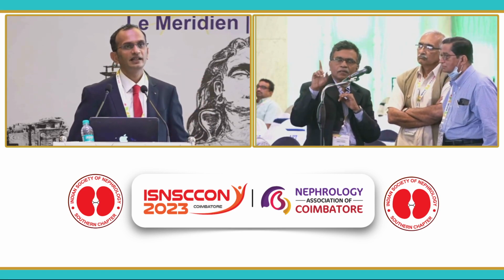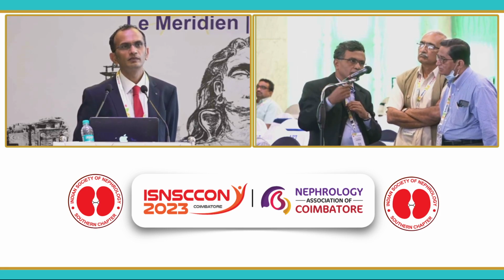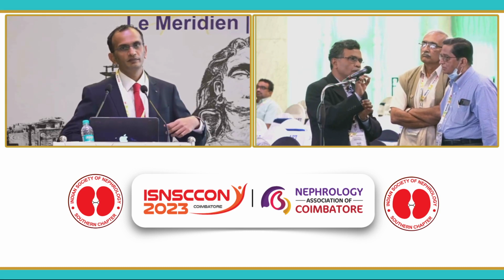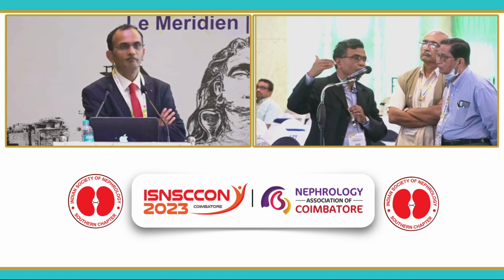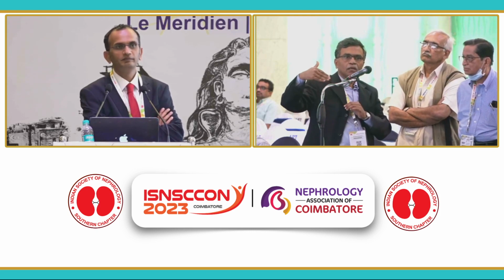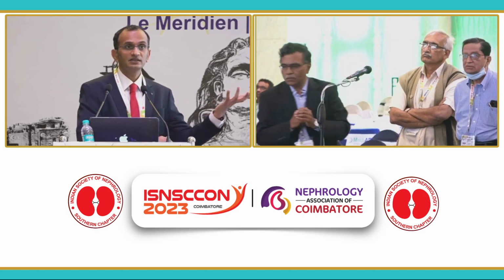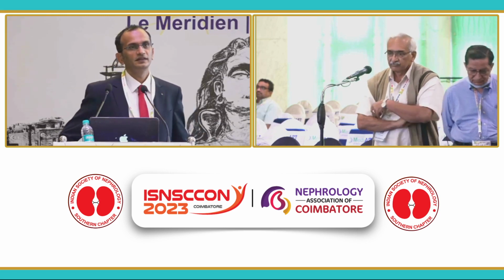Yeah. May I make a suggestion? I think, sir, what they're proposing is not the occlusion of the entire capillary, but just the pores at a micro level. That may not necessarily translate to a bundle volume change at the end of a single dialysis. Maybe if this is applied over 10 dialyses, you may see a difference in the bundle volume between the two arms of the study. Hence, that is the reason maybe we didn't see much difference in the Kt/V. And Professor Kasi Vishweshwaran.